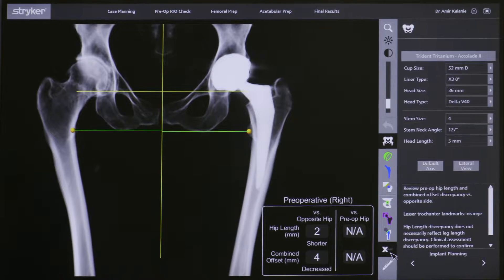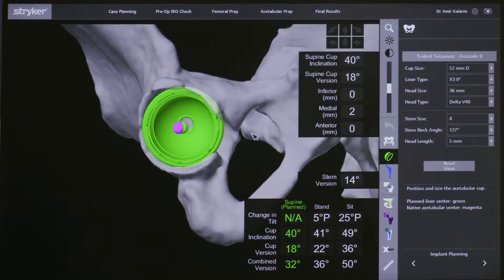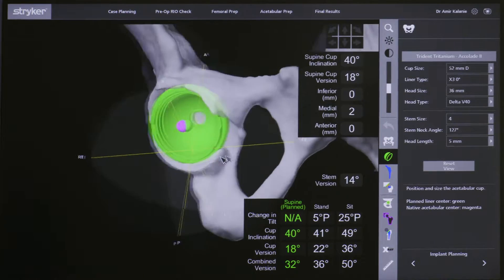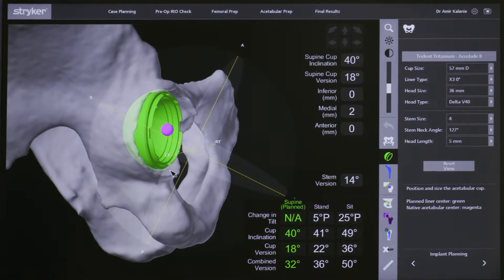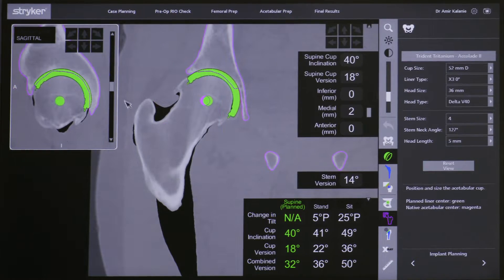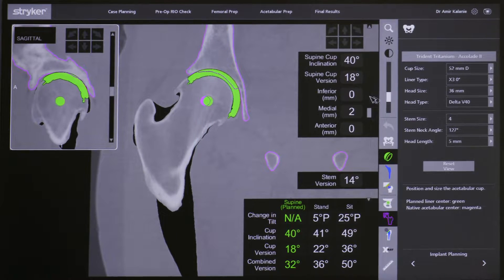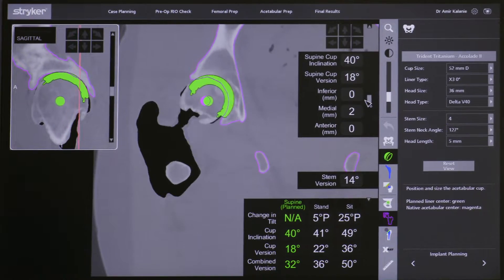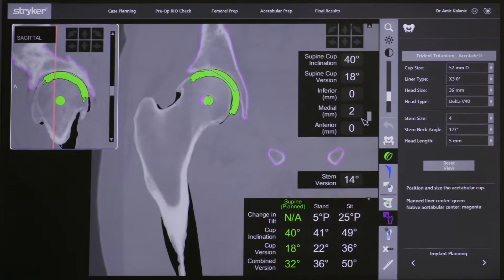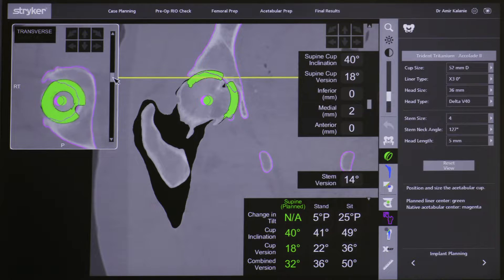The planning starts with the acetabular side first. The three-dimensional scan allows me to accurately assess the orientation and sizing of the cup on multiple planes. This allows me to position the cup in the best bone stock for the patient and also to restore the anatomic central rotation as well as the combined femoral and acetabular offset.